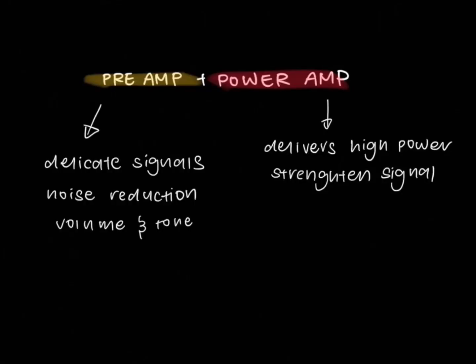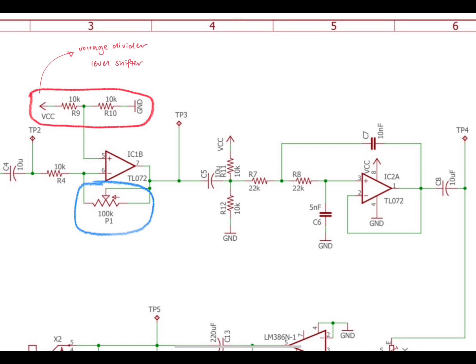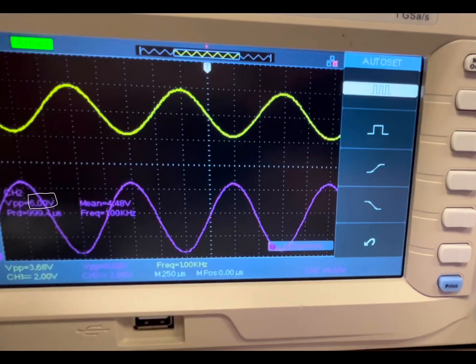In most audio systems, a power amp, as shown in stage 2, requires a preamp, as shown in stage 1, to function optimally. By dividing its amplification process, the preamp handles delicate signals, noise reduction, as well as volume and tone, while the power amp delivers high power and strengthens signal. Resistors 9 and 10 are voltage dividers that acts as a level shifter with functions as discussed before in stage 1. To set up stage 2, we will place oscilloscope probes in both TP2 and TP3 and leave the power supply and function generator untouched.